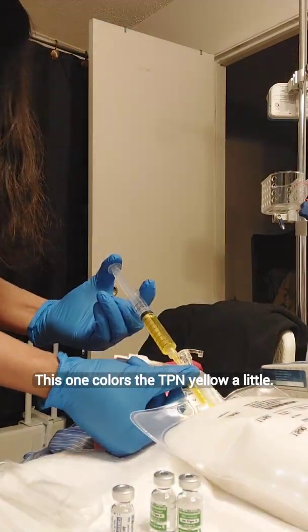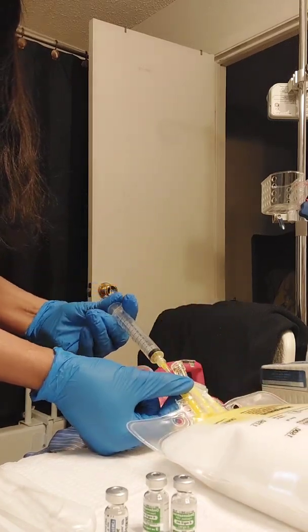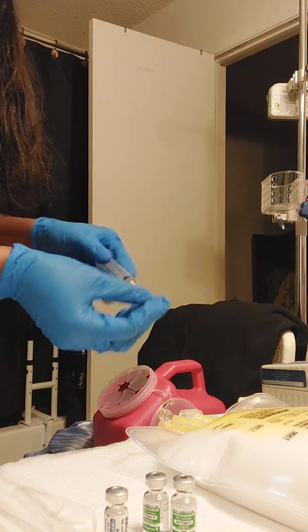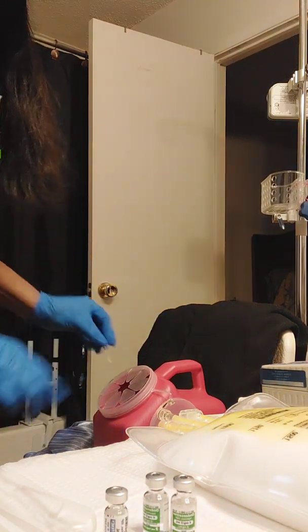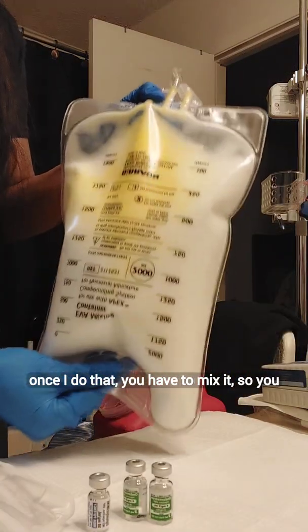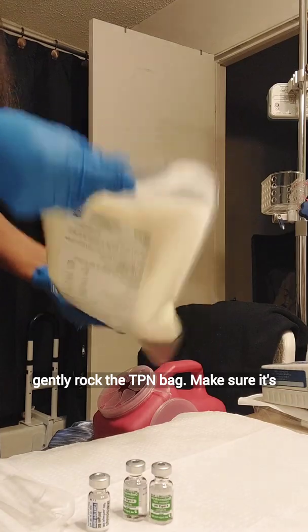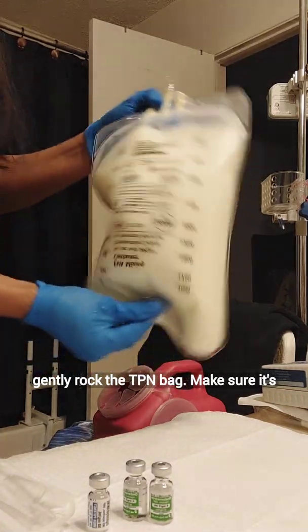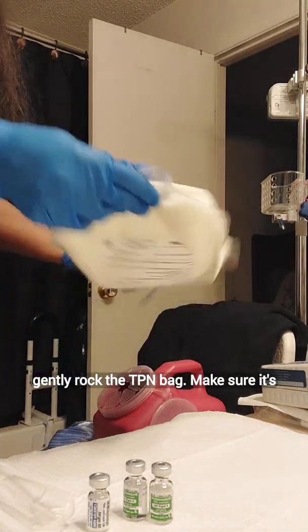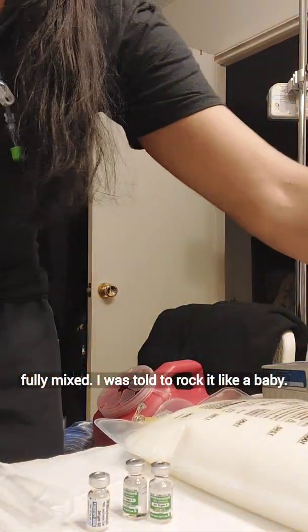This one colors the TPN yellow a little bit. Once I do that, you have to mix it, so you gently rock the TPN bag. Make sure it's fully mixed — I was told to rock it like a baby.